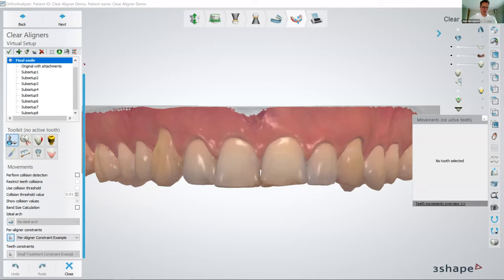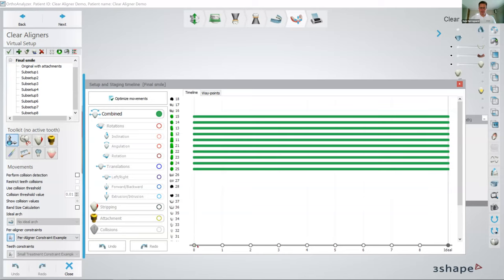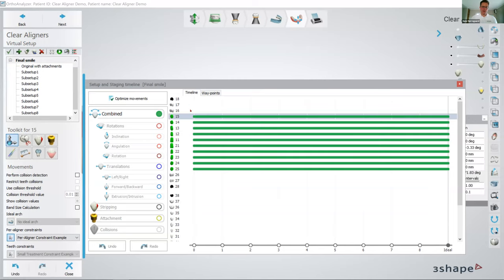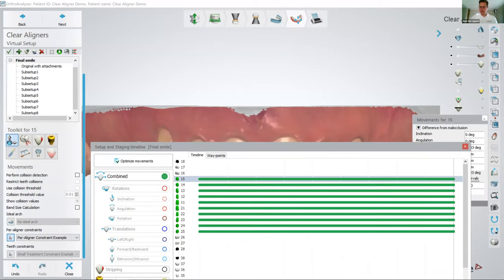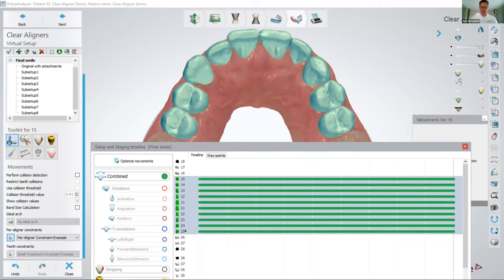realistic treatment. So we have something we call a setup and staging timeline. It looks like this. Here you can see the aligner, the number of aligners that is needed in order to create the treatment. We can see a combined teeth movement on the teeth. So all of the teeth here. Let me just take a view from the top, because then we can see the teeth. So if I select the teeth that have movement, it's all the green teeth here.